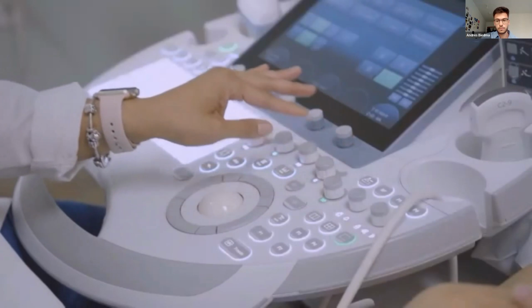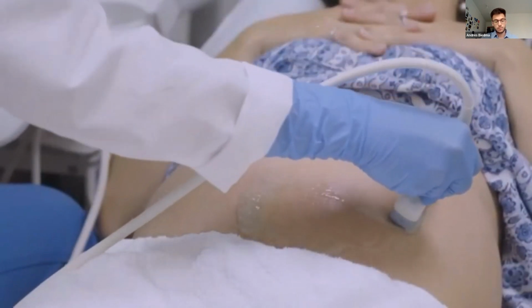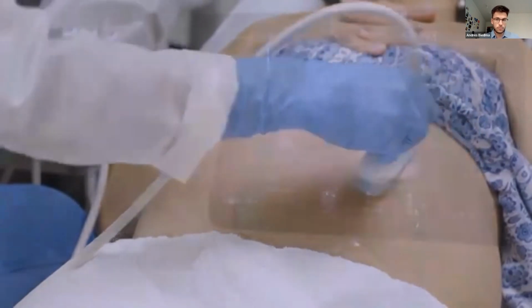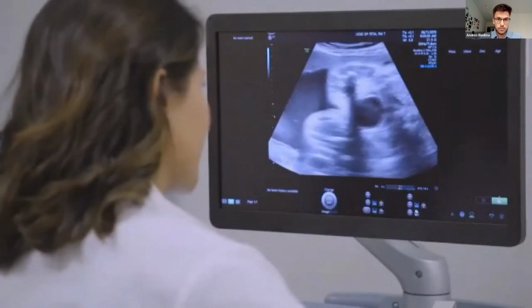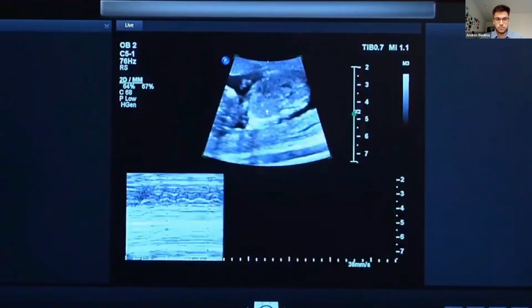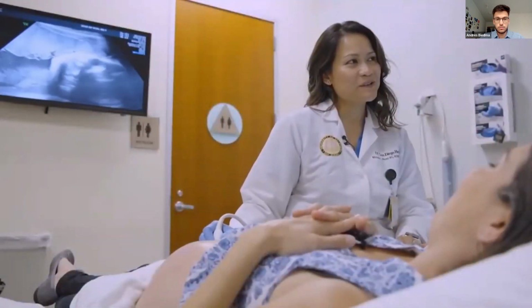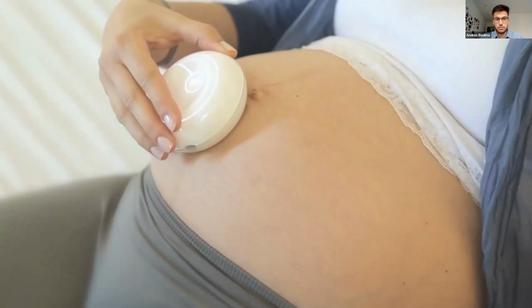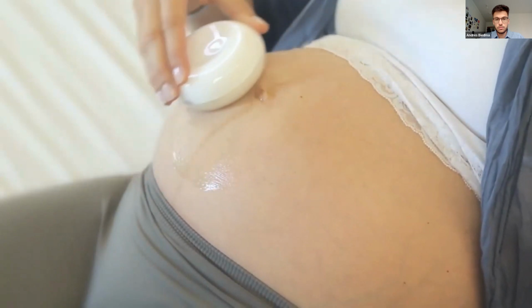Monitoring a fetus's heart rate during pregnancy is one of the main indicators of the well-being of the fetus. Commonly, expectant mothers make appointments regularly and visit clinicians for monitoring sessions. With current enhancements in technology and also the effects of the COVID-19 pandemic, at-home monitoring devices became attractive, including cardiotocography devices for fetal heart rate monitoring. There are various commercially available home monitoring CTG devices on the market, which brings us to the question: can we trust these devices? Are they as accurate as they are claimed to be?